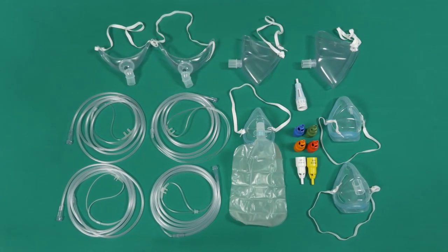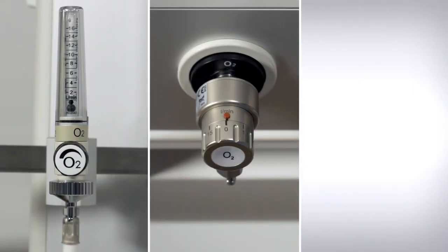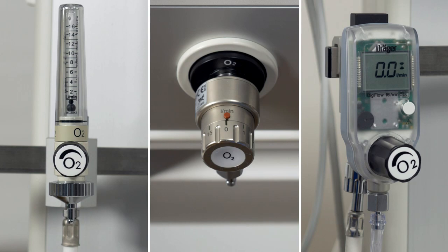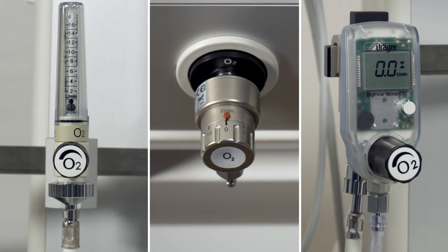Draeger offers the following flowmeters for oxygen therapy: O2 flowmeter, compact flowmeter, and electronic DigiFlow O2 flowmeter. During an oxygen therapy, a flow of up to 15 litres per minute is administered.